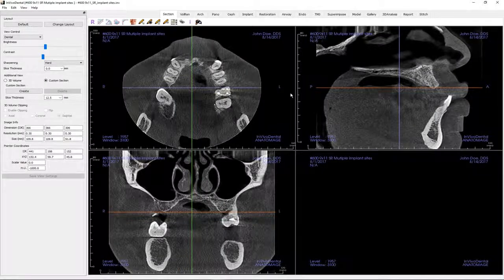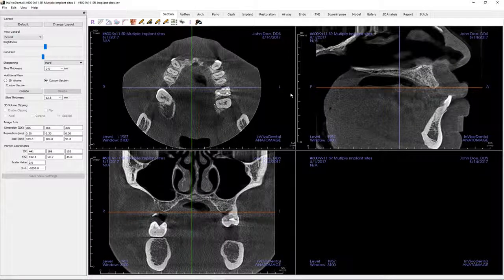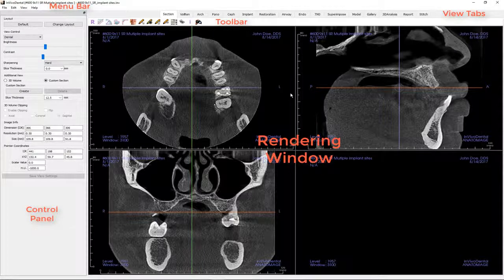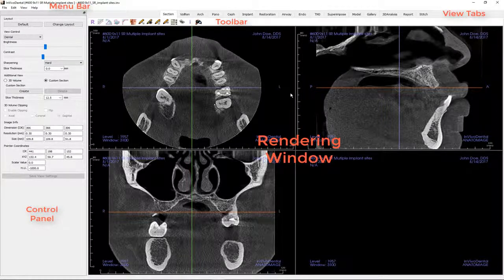The screen layout of Section View, as well as that of the other view tabs, will have a menu bar, toolbar, view tabs, control panel, and a rendering window. All but the menu bar and the view tabs will change depending upon the view tab selected.